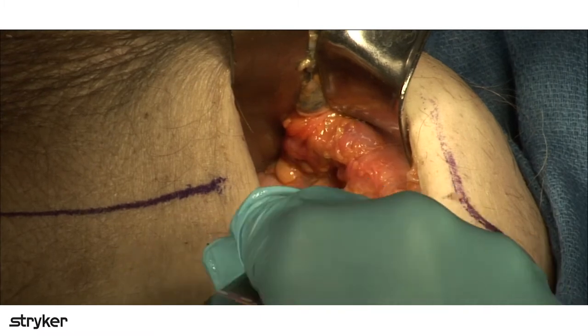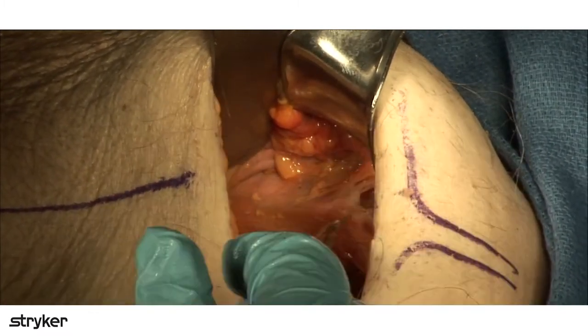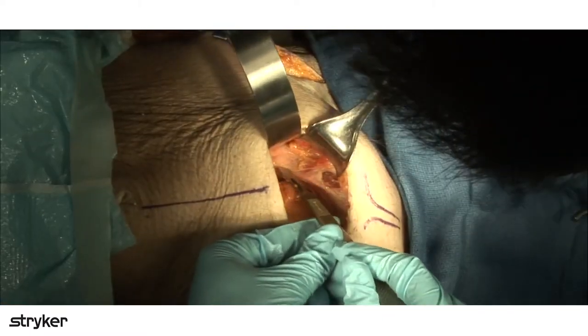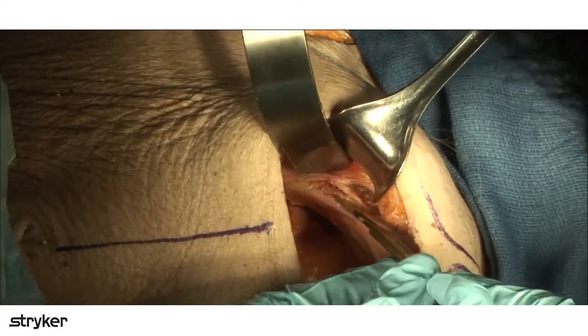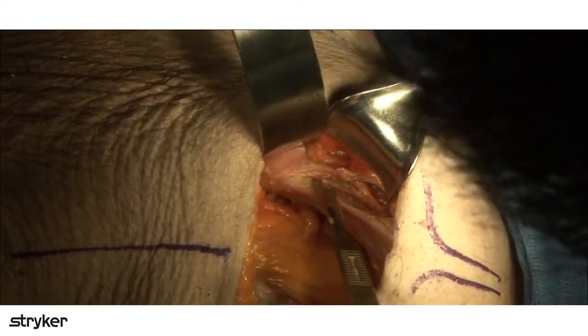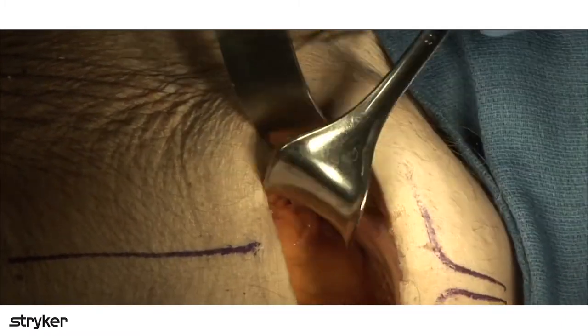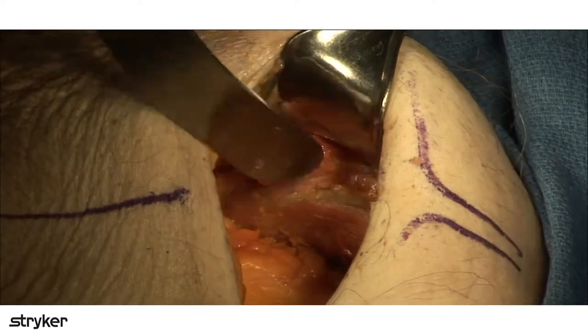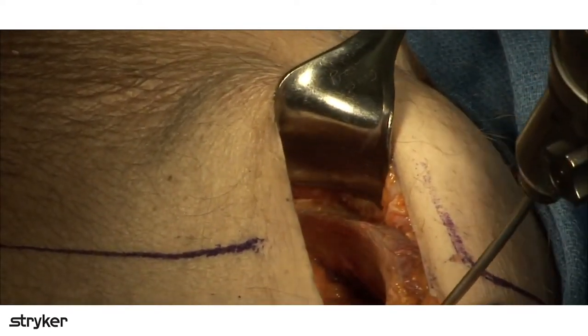And so a little bit of muscle fibers you see under there, that's the pectineus muscle. All right, and so we're going to just take the iliopectineal fascia off the superior pubic ramus. Usually you'll see a fracture line right here at the beginning of the pubic root. Remember the front of the pelvis here, I'm going to put a K-wire just to hold this skin out of the way so it's easier for you all to see.